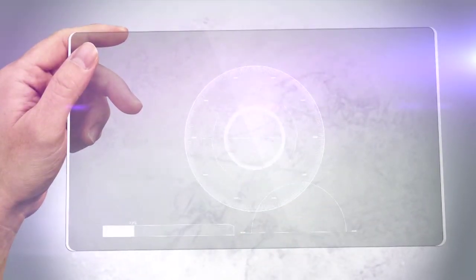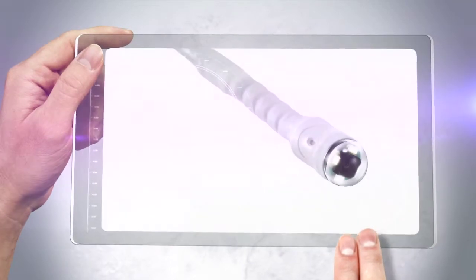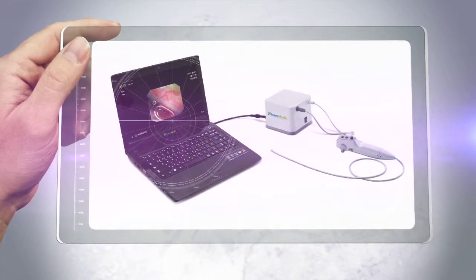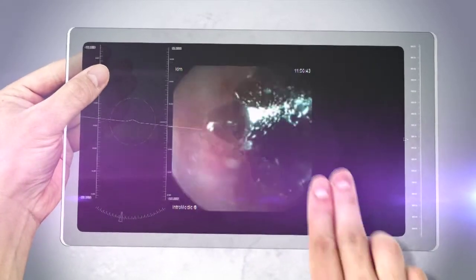EG scan is an esophagoscope designed to visualize the lining of the esophagus as an adjunctive tool in the detection of abnormalities of the esophagus. Visualized images are viewed via EG View software installed on the display system for diagnosis of disease related to the esophagus.